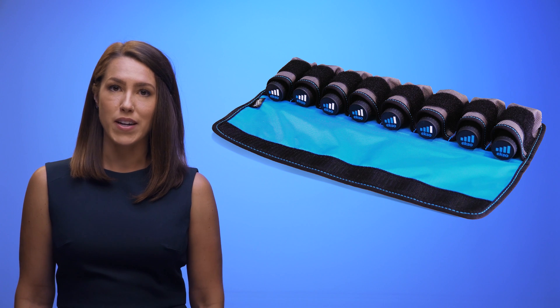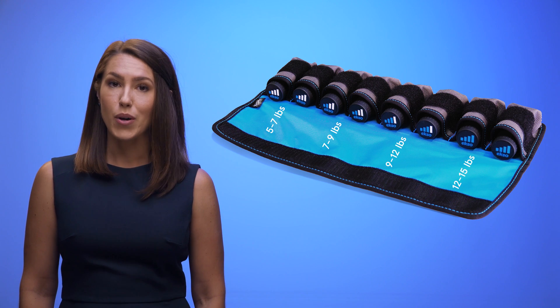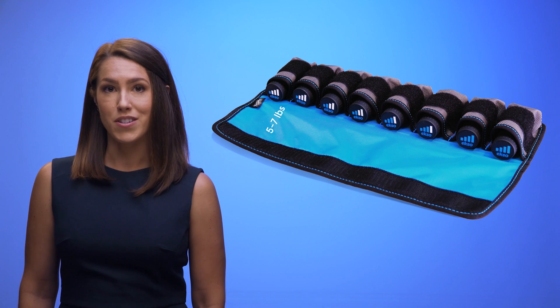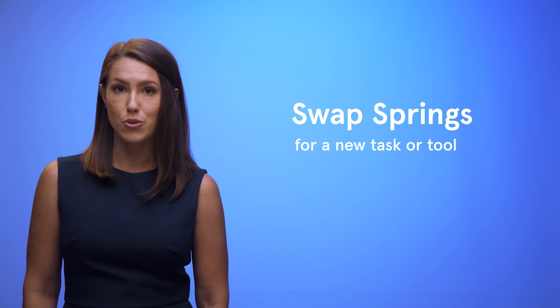Your ExoVest is powered by springs. Level 1 gives you the least assistance, while Level 4 gives you the most. We recommend that you start with Level 1 springs, but if you feel that you need more assistance, you can swap them out. You might also need to change them if you're getting the ExoVest from someone else or if you're switching to a new task or tool. Remember, you can use a different spring level on each side.